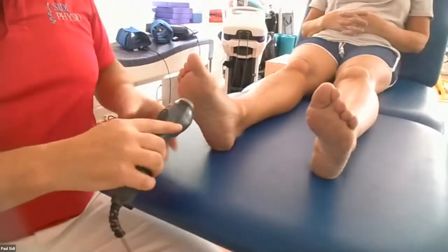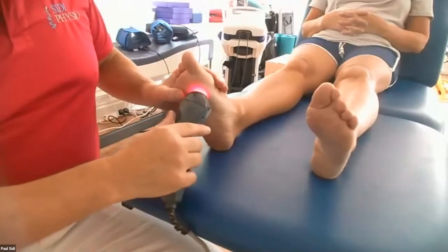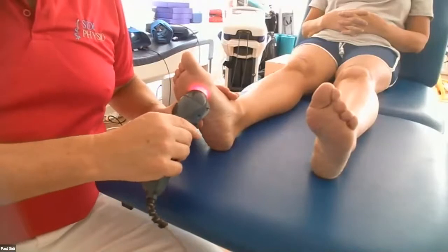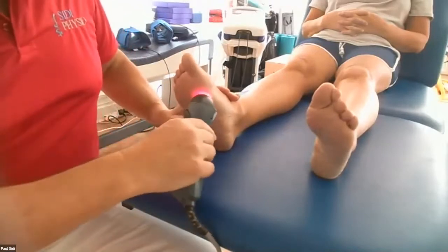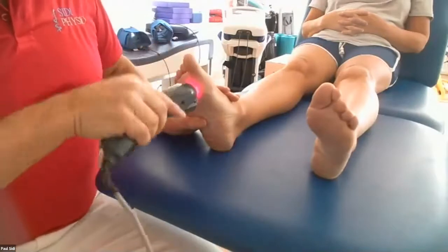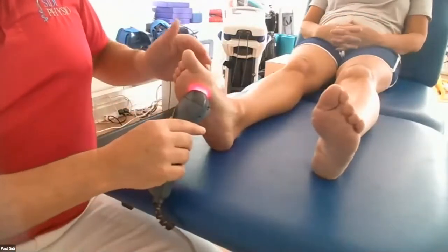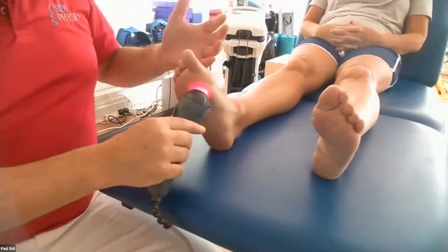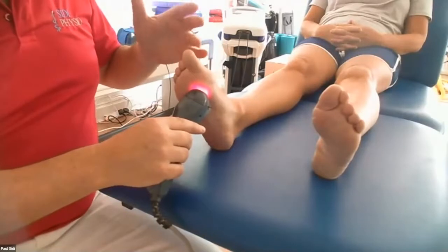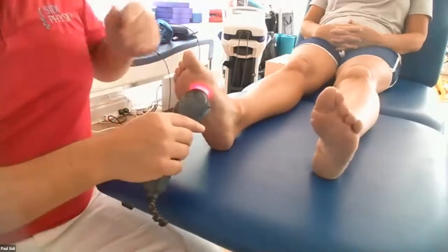What we like to do is actually start getting some movement in here. I've got that on there, and you can probably see it's going in that area. I'm going to do 5 points. It will stop each time, and we move it around, okay? But at the moment, I keep it completely still, and we don't have to worry about heat. First time, no problem with them not moving because of so much pain. But this works so well, and it will reduce the pain quite markedly.